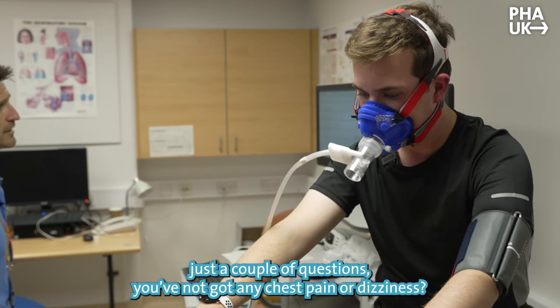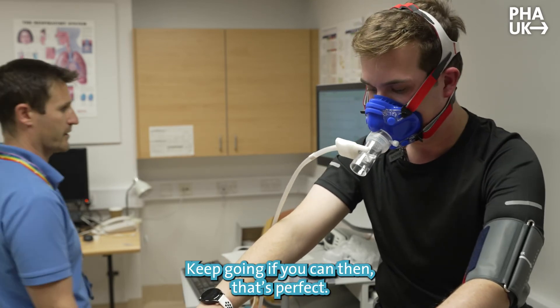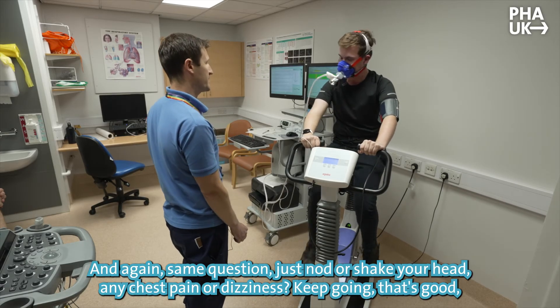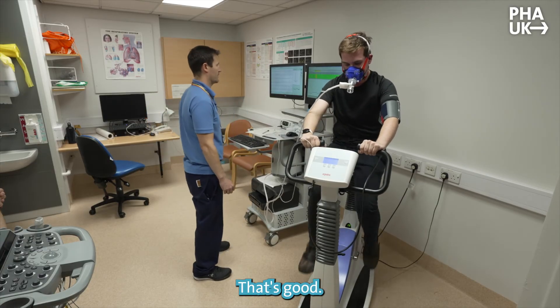You've done a couple of minutes already Adam, just a couple of questions. Any chest pain or dizziness? Perfect, keep going then. Same question — any chest pain or dizziness? Keep going then, that's good. You're doing really well, keep that pace going.